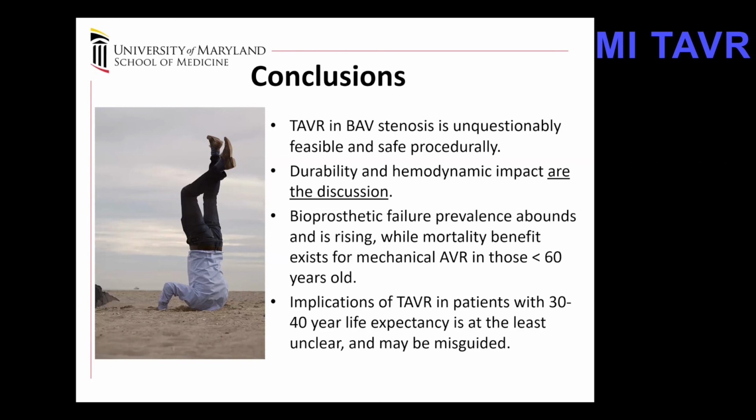And I would close with just the provocative statement: what are the implications of using TAVR in bicuspid patients that have a 30 to 40 year life expectancy? I think it's at least unclear at this point, and taking on an aggressive TAVR posture may be misguided.